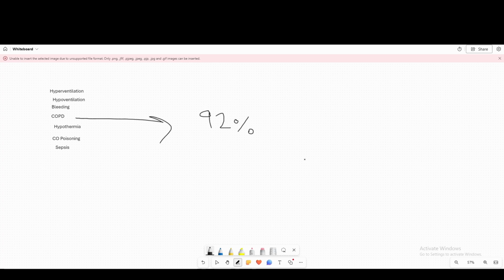They just have so much blood that they require a lower percent of saturation to actually properly perfuse all their tissue, right? I thought that one was pretty interesting. Hypothermia. So this is hypothermia, right? It can be an interesting consideration when it comes to accuracy of the pulse oximeter, right?